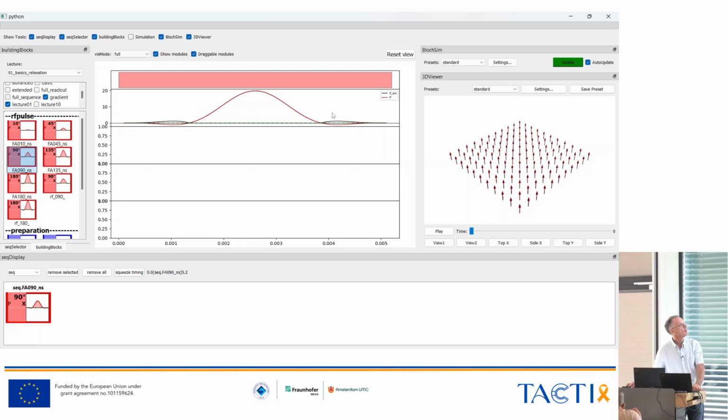That's why most of the times everything is just put into one curve or one waveform. So this diagram up here would just show everything which is related to the radio frequency pulses or the data acquisition, and then the different gradients would have different diagrams here. Right now we are not using any gradient. So not for you to repeat, but just to show you how it would look like for a complete sequence.